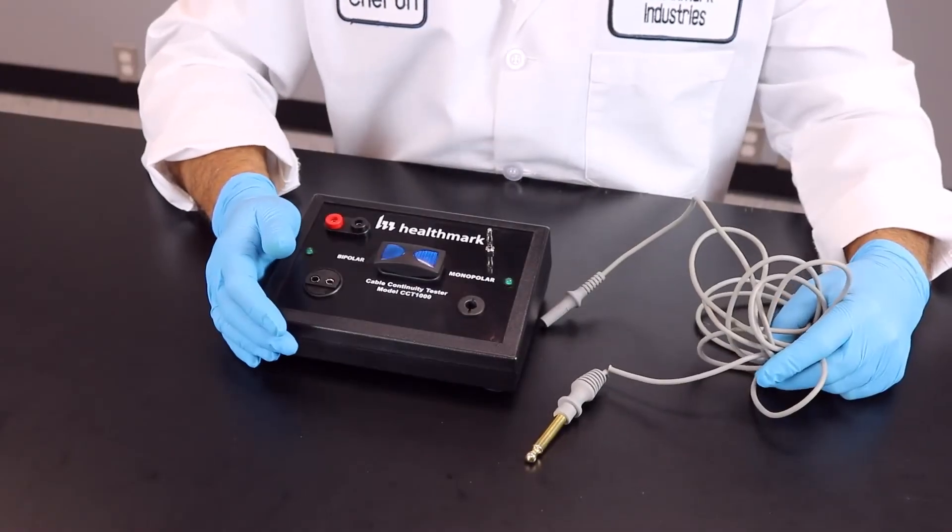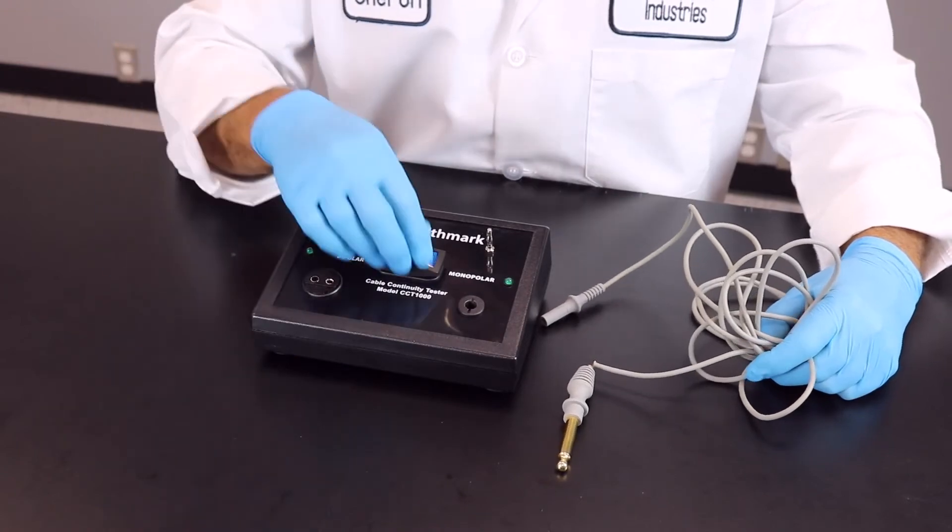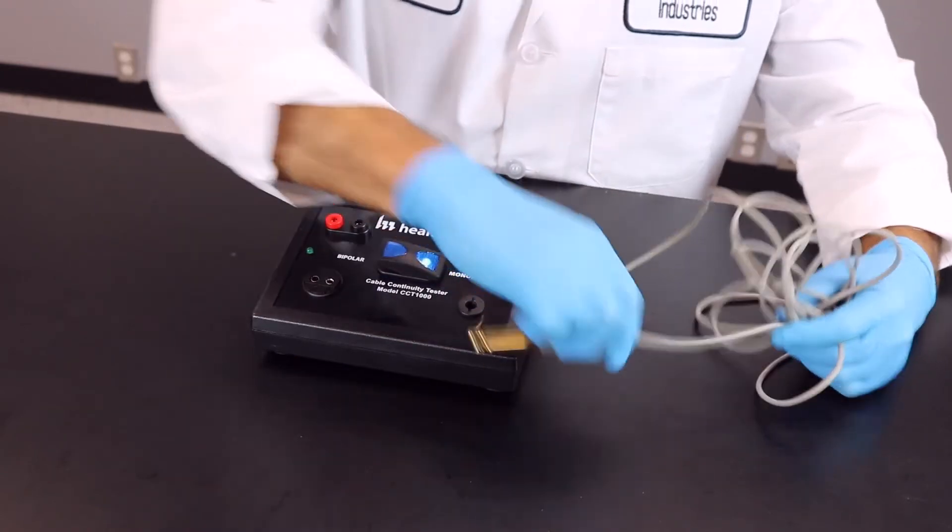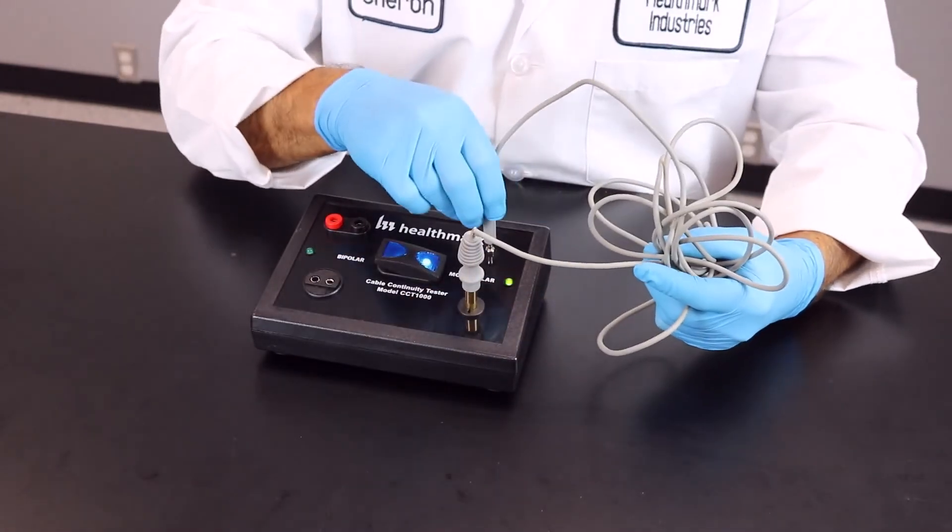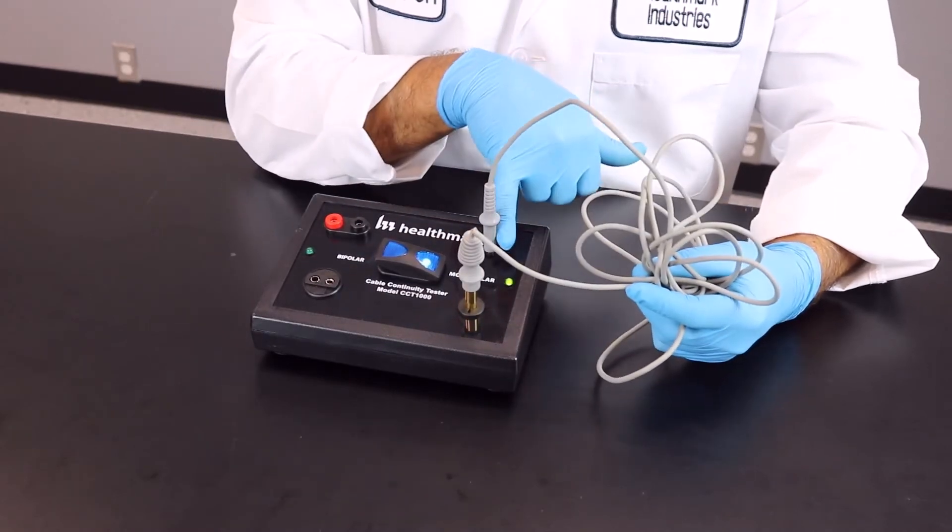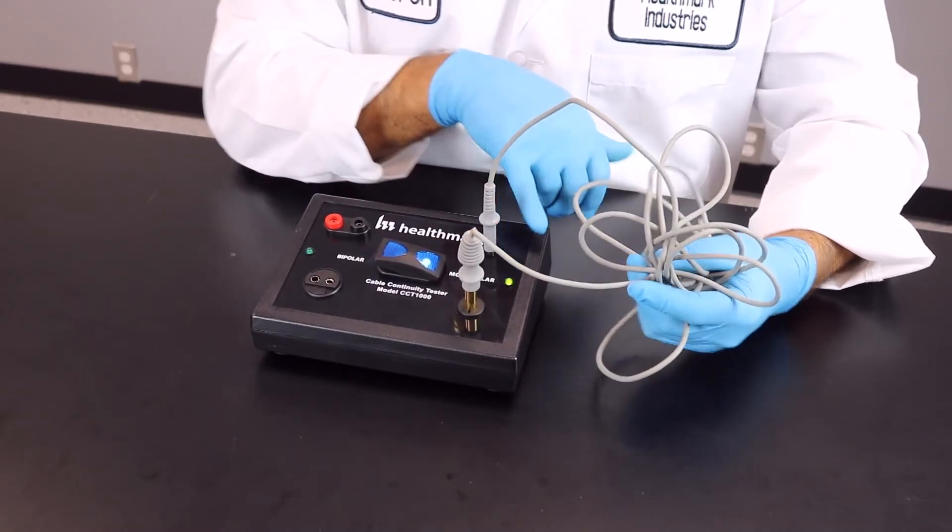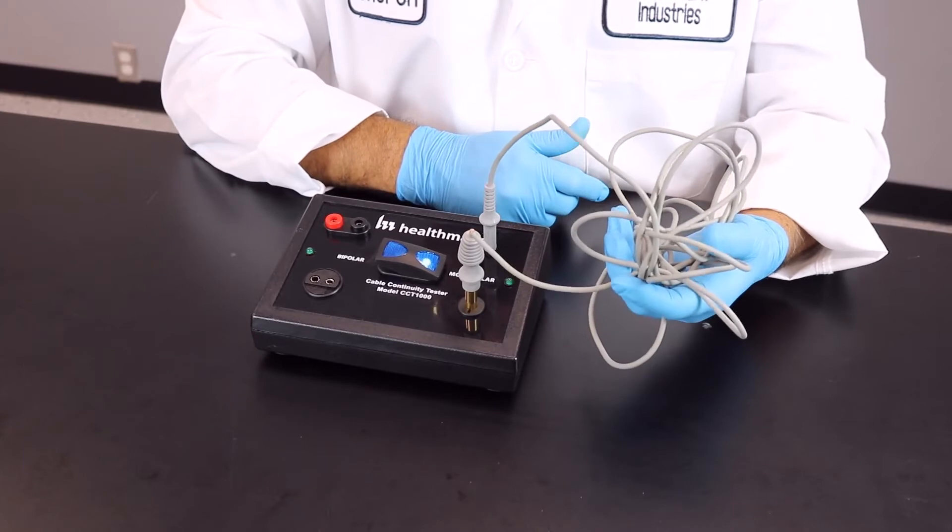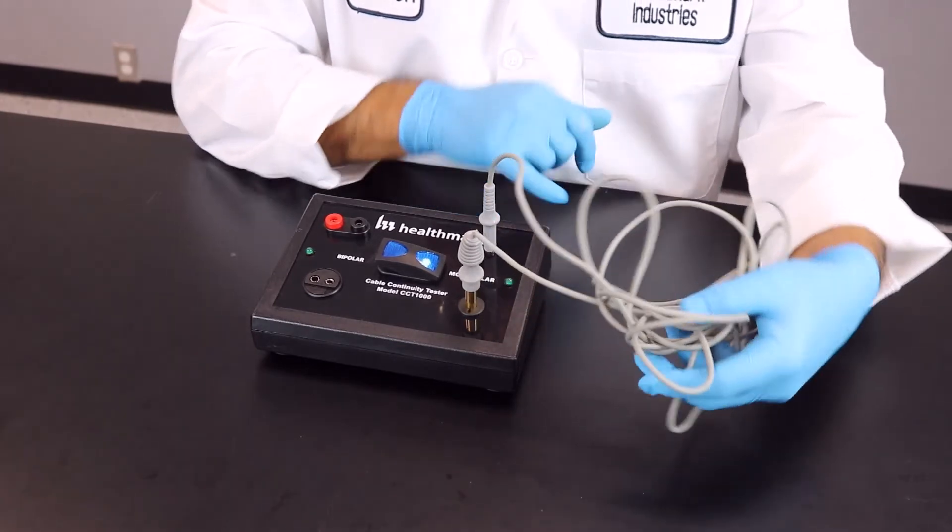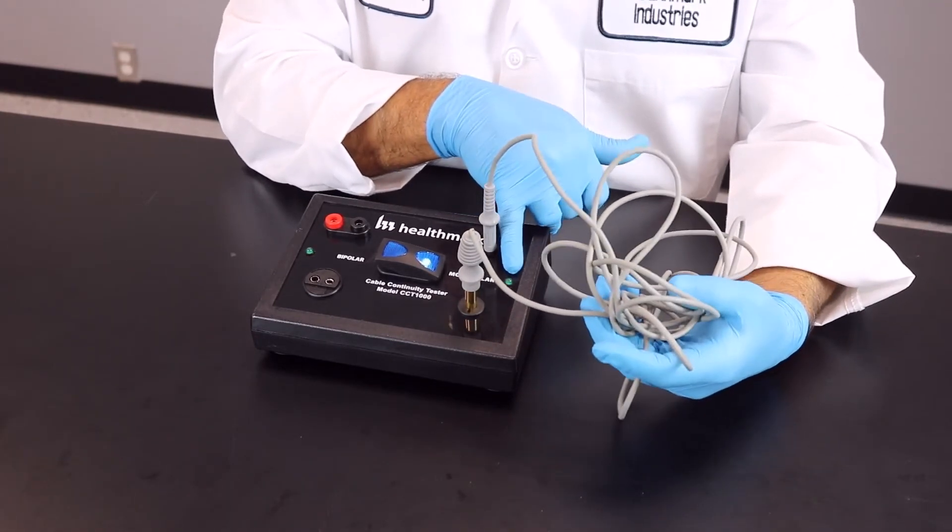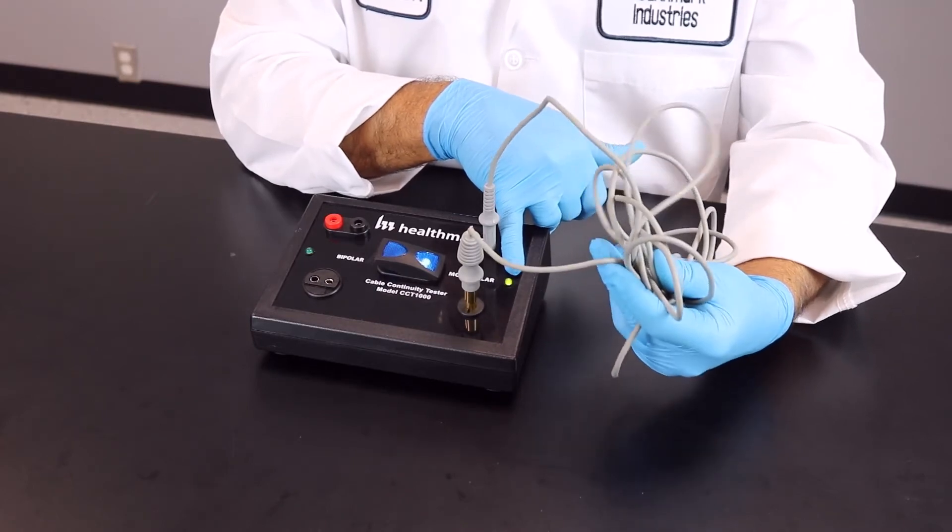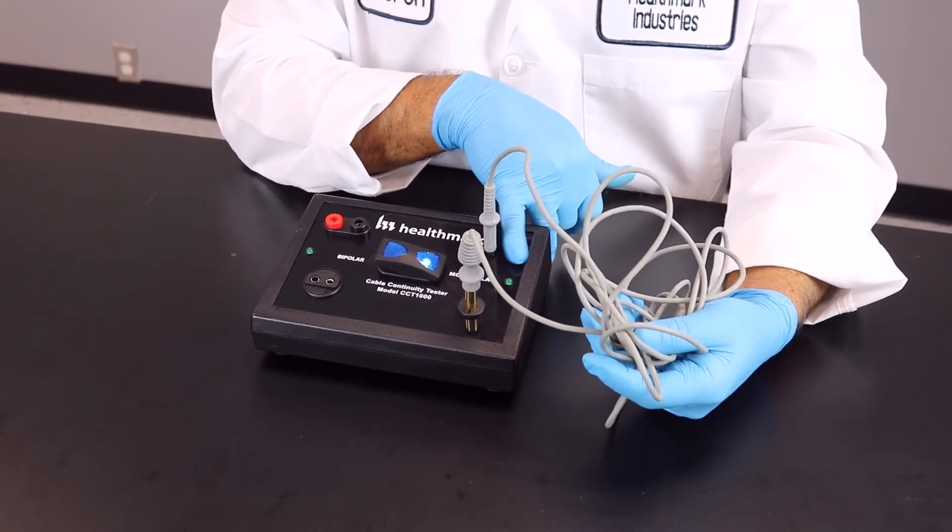So now we're going to show you a damaged cord that's going to fail. So we're going to insert the cable and you're going to notice the light goes on and it's flickering and I haven't even started playing with the cord yet. As you can see, I moved it around and the light doesn't go on. This is signifying that there is a break or almost a complete break within the cable and this is damaged.